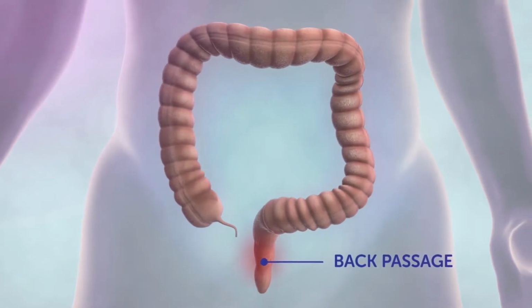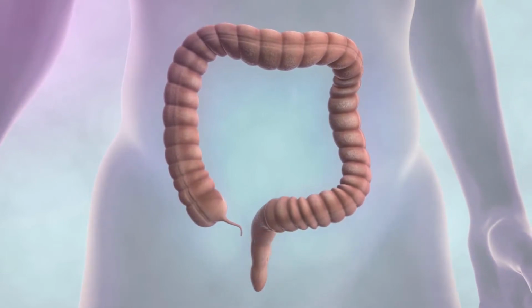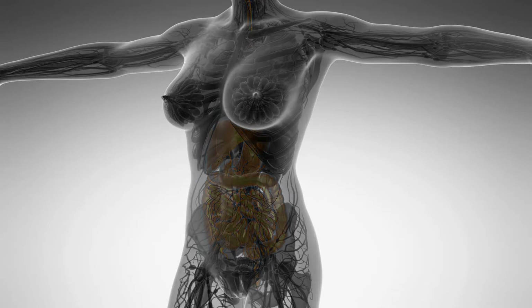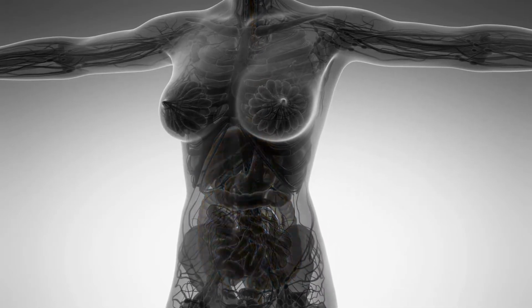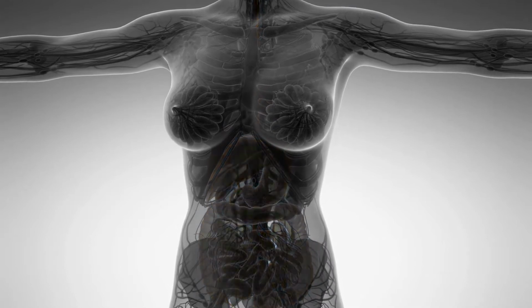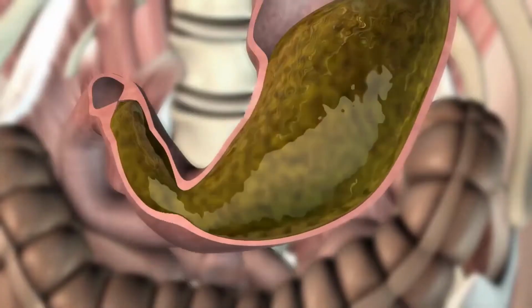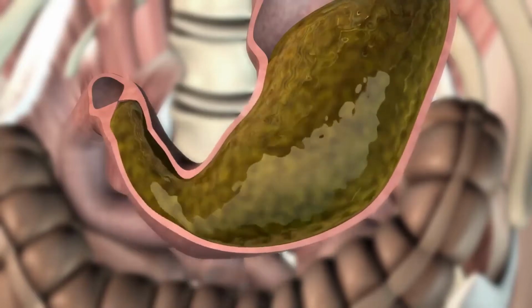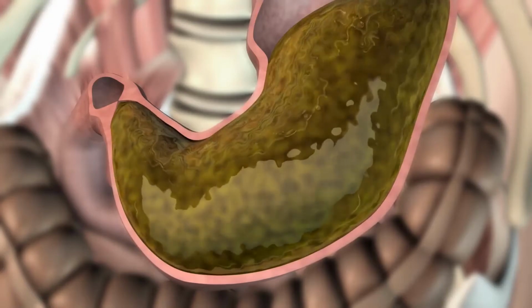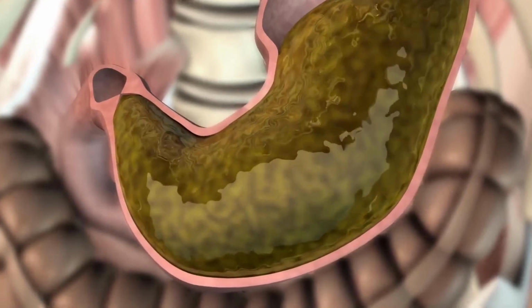A colonoscopy and esophagogastroduodenoscopy are two endoscopy tests used to examine the digestive system. A colonoscopy, also called a lower endoscopy test, is done to examine a patient's entire colon and rectum. The scope is threaded through the rectum while the patient is sedated. Colonoscopies are usually performed to screen for cancer or to diagnose another medical condition. A sigmoidoscopy is a test performed on the lower portion of the colon only.